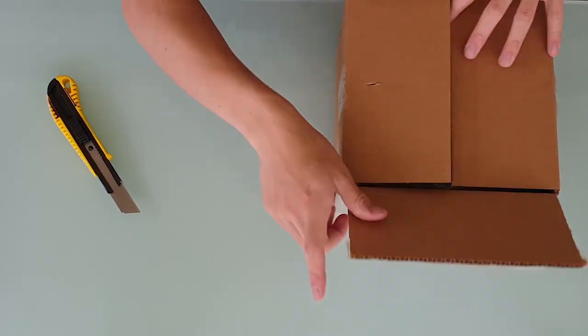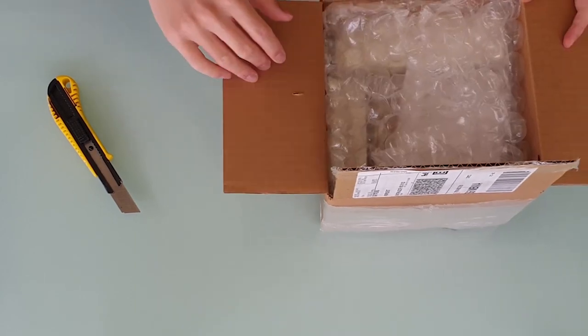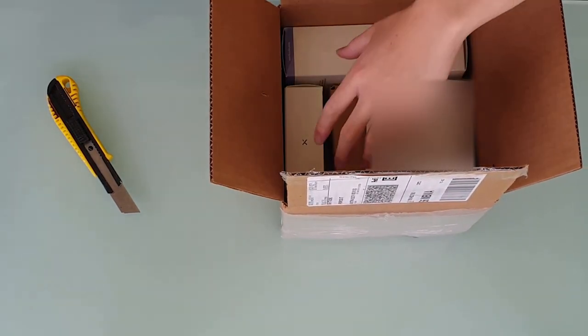Hey guys, I just wanted to do a quick unboxing of the Lexi Lumen hearing aids. They've just sent me out a review unit for me to check out.